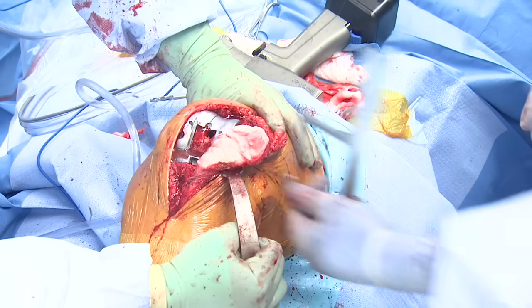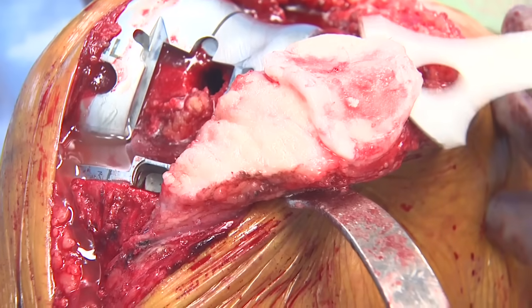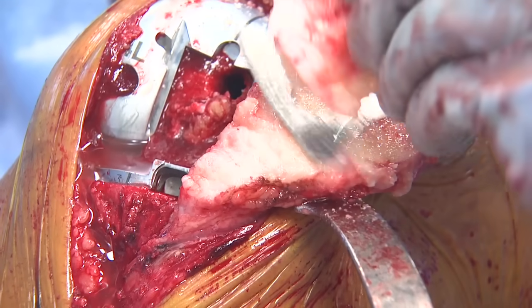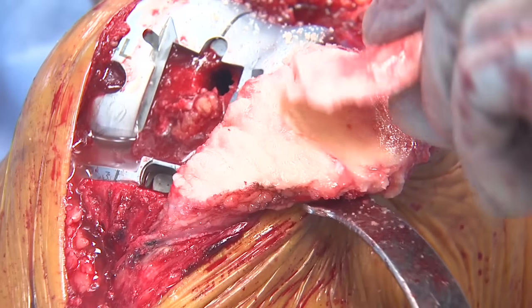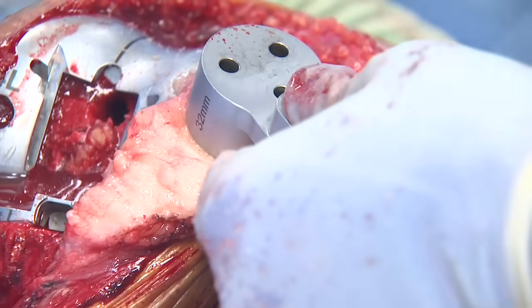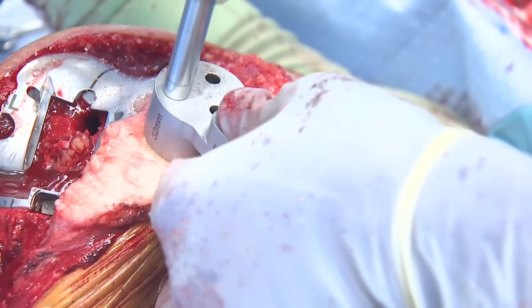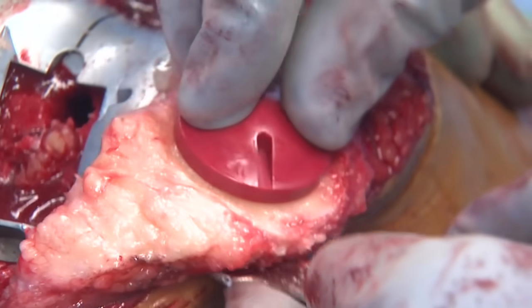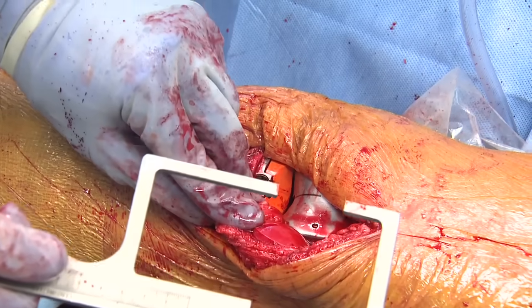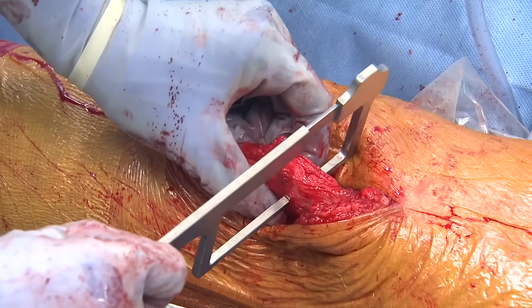For illustrative purposes, this patella measures approximately 22mm. A resection using a fan blade saw is then made. Sizing to a 32, the patellar punch is utilized and the patellar button is then applied. This confirms appropriate restoration of the patient's anatomy.